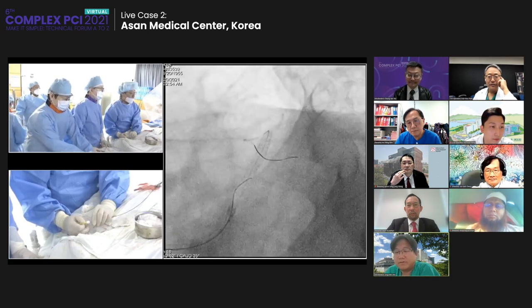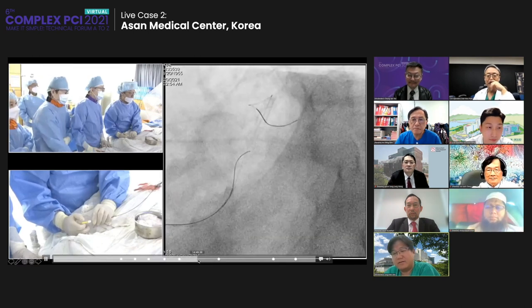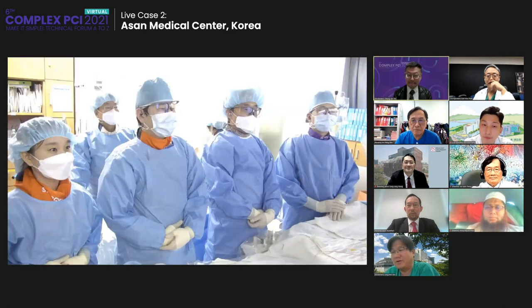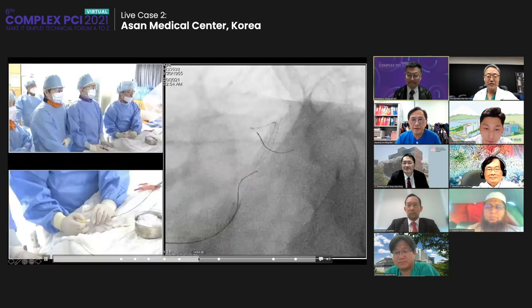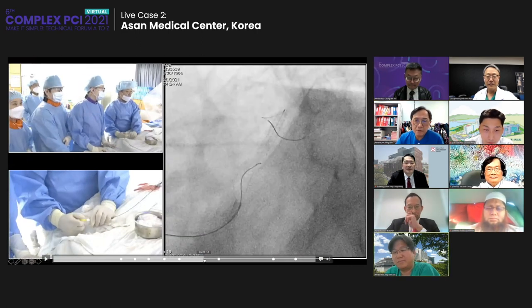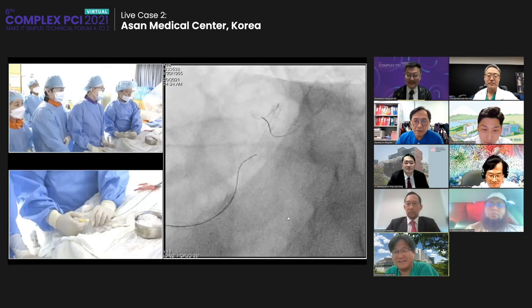Actually, some operators want to change the guiding catheter to the XBU or EBU. Sorry. Okay. Welcome to 2021. For the stronger backup, actually, this is our center's style. It's routine.